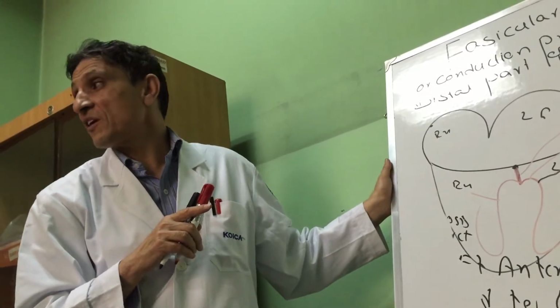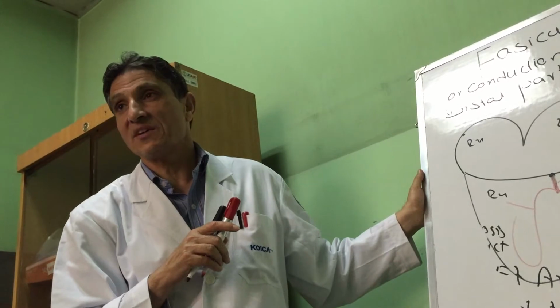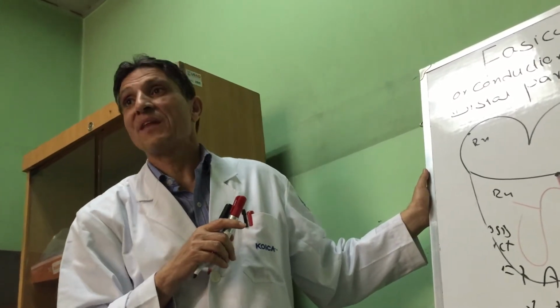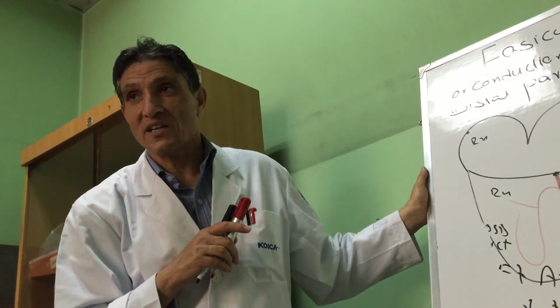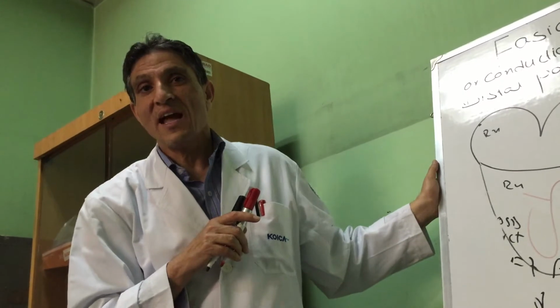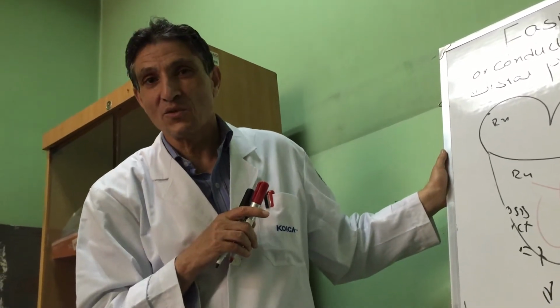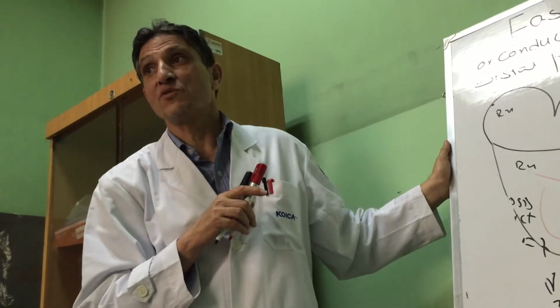And in the ECG we will see the criteria which is the indication for left axis deviation. The criteria of the ECG of a patient who has left anterior fascicular block, or left anterior hemiblock, is left axis deviation. Left axis deviation has a positive QRS complex in lead 1 and a negative QRS complex in leads 2 and 3, and the axis would be in the range of -40.